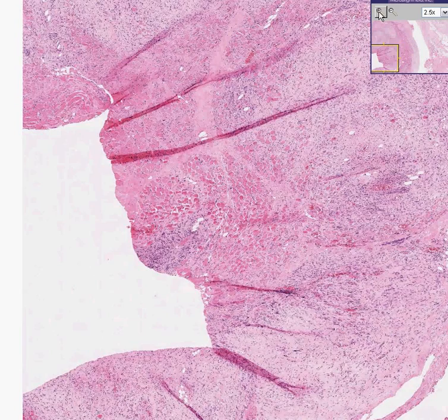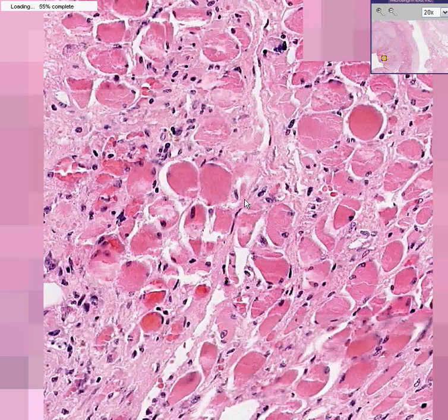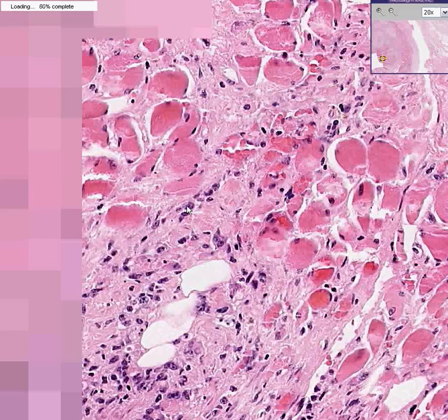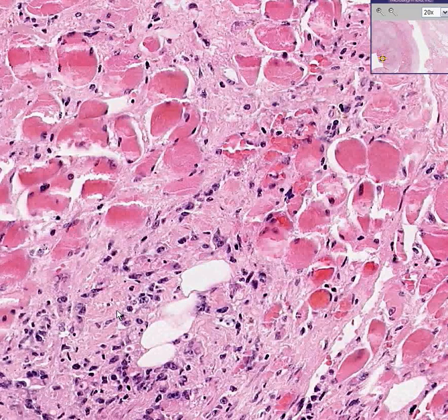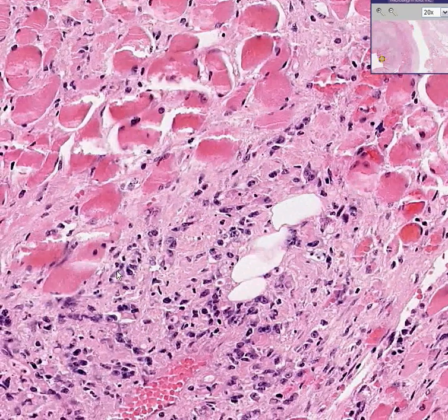Here's some muscle cells. Here are some very subtle tumor cells. Notice how insidious and subtle they look. They don't look very much like tumor cells as well. And even a cell as small as this or this or this or this could represent tumor cells, because they are. And certainly these are over here.